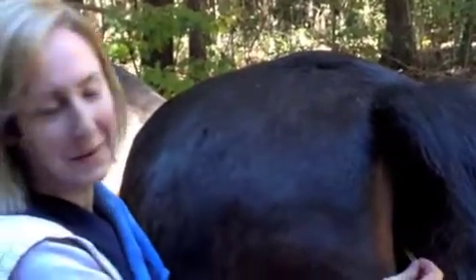Temperature in an equine. I'm sorry baby. You might not want your head there on a normal horse who's not sedated. He's sedated so I can get away with that.